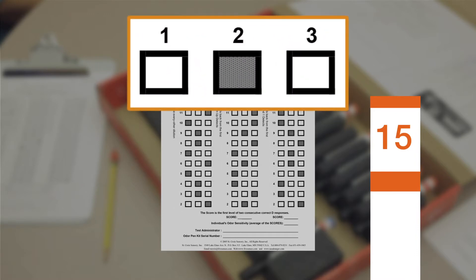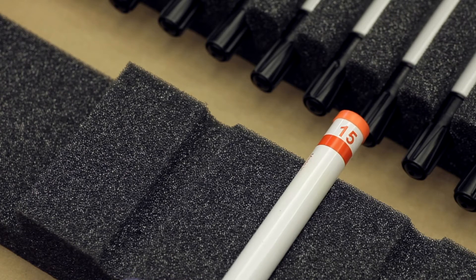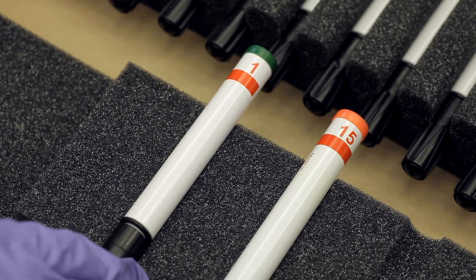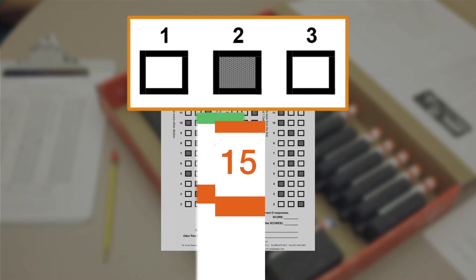One of these is different from the other. We will start the warm-up with the butanol pen number 15, placing that pen in the center position, and one blank pen in the left position. We will use the blank pen twice, in the left position and the right position. The test administrator then begins to present the pens in sequence, left, center, and then right.